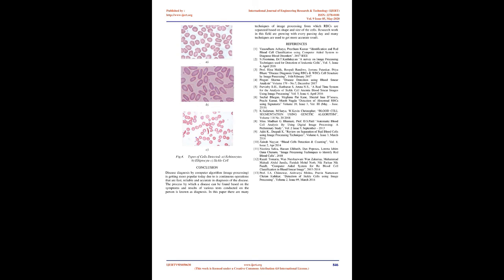2. Feature extraction. Area. Diameter 1. Major axis represents the measure of the major axis of the ellipse. Minor axis represents the measure of the minor axis of the ellipse. Drawbacks of the system. In 1, 1,000 images were experimented for diagnosis. An accuracy of 98% was identified correctly for type of anemia which was evaluated by the medical experts/pathologists.